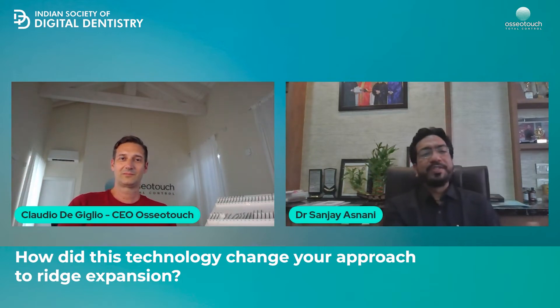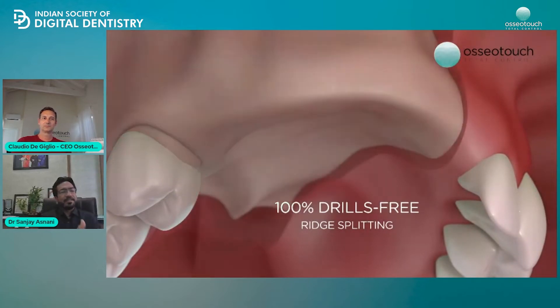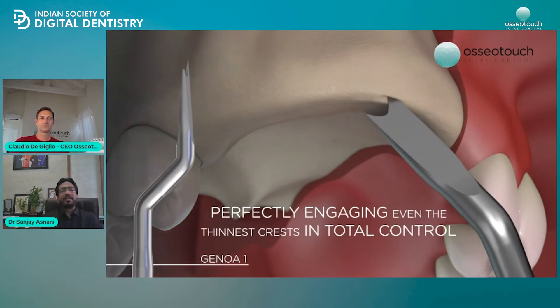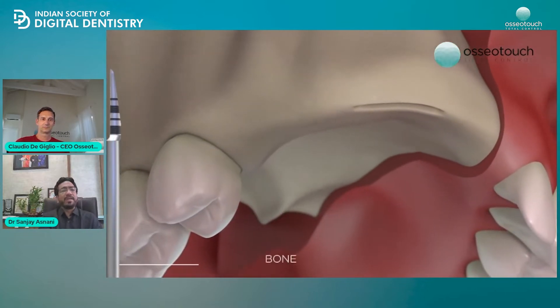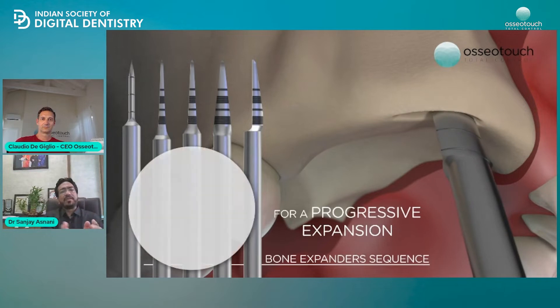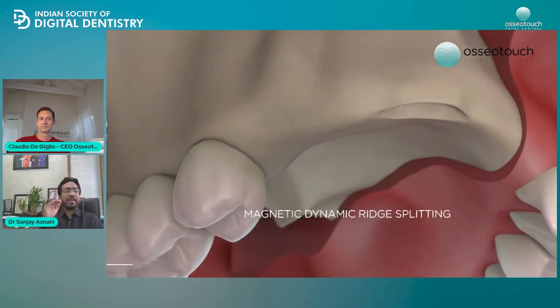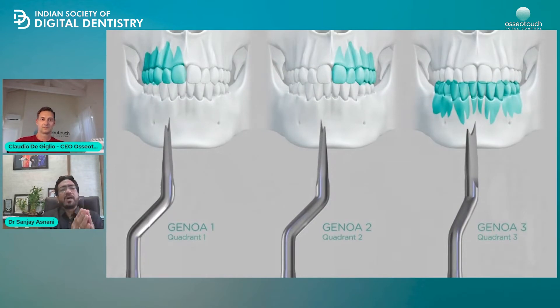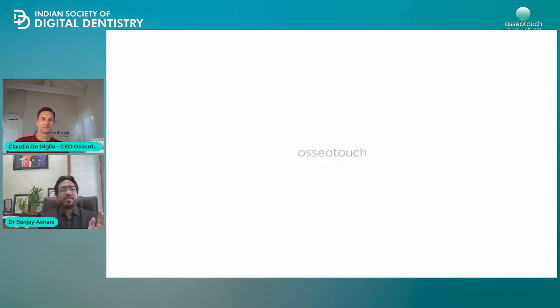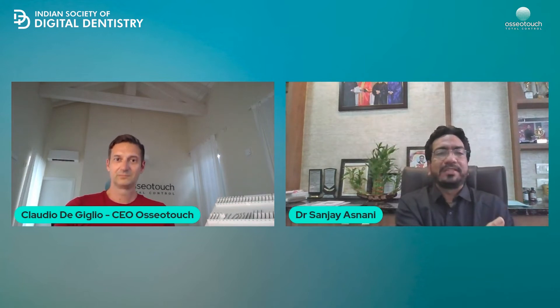Previously, we used expansion screws and burrs to first give cuts to enter the bone, then place expansion screws, expand the bone, and then place implants — it was not very precise. Now with the new Genoa tip, it is useful in very thin ridge cases where you have only one millimeter of crestal bone remaining, and you need to expand that. With normal expansion screws this is not possible. But with this new tip, it has become very easy. Once you enter the bone, it spreads very smoothly and the bone expands without damaging or fracturing the adjacent bone. You are very safe, and once it enters the cancellous bone, it becomes very easy. You just need to hold the instrument properly and give the cut at the cortical level — that's it. Once you are done, it is through.